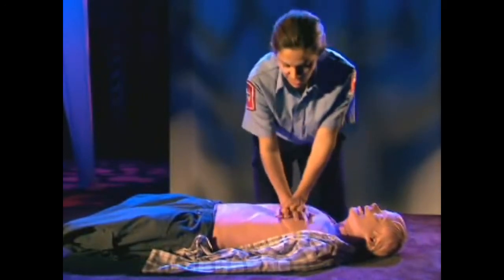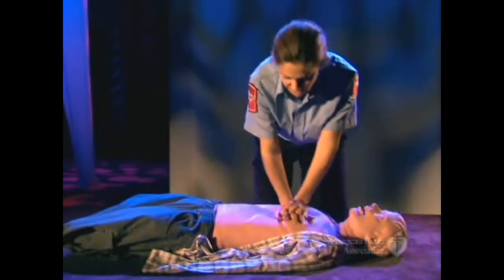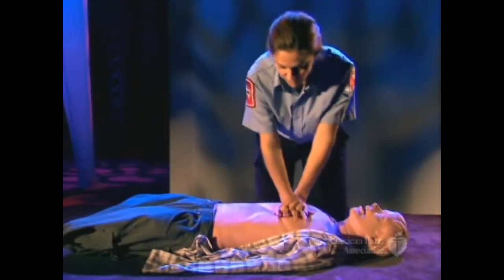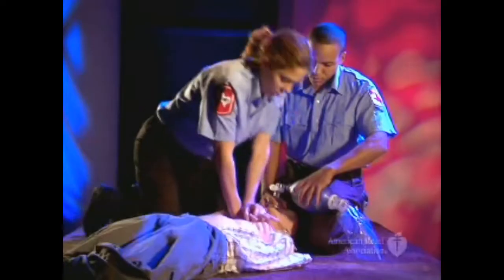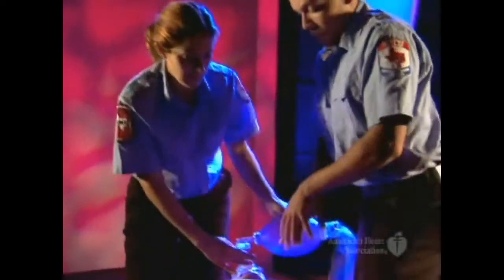When another rescuer is available to assist with CPR at the scene, the second rescuer should activate the emergency response system if he or she is not already, and get an AED. Help is on the way. In two rescuer CPR, each rescuer has specific roles.